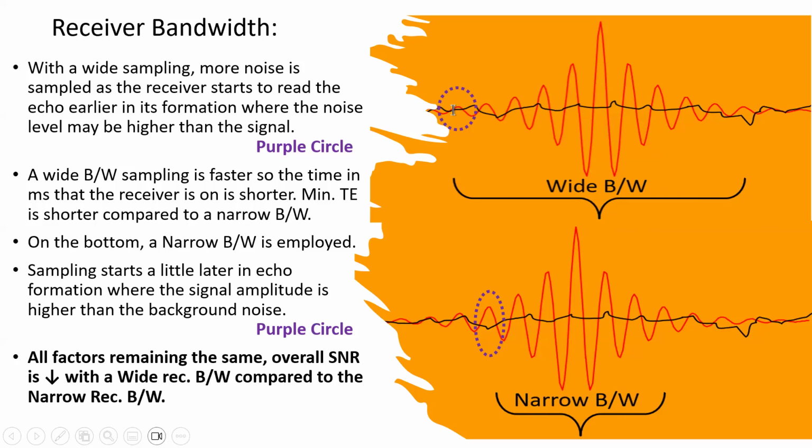It's in the garbage. So you got low signal to noise included in your K-space. Your overall signal to noise drops. But with wide bandwidth, you're done with this echo quickly. So your minimum TE goes down and your chemical shift goes down.